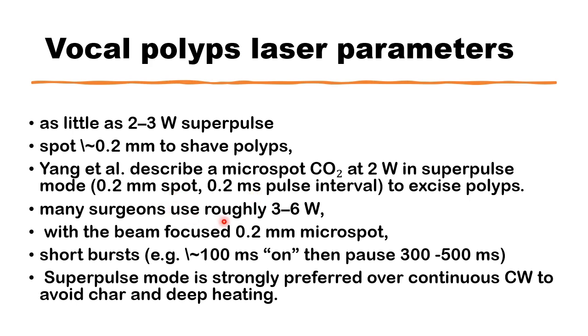Many other surgeons used somewhere between 3 and 6 watts, again with the beam either focused into a very small spot or a straight or curvilinear line. In short bursts, it was 200 here, it can be 100 milliseconds on for others, and off between 300 and 500 milliseconds. The super pulse mode is strongly preferred.